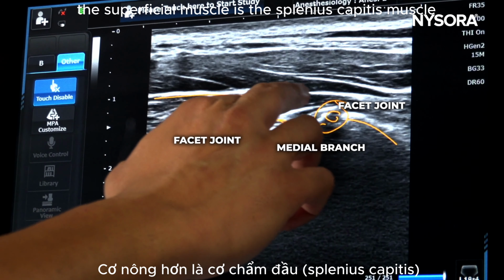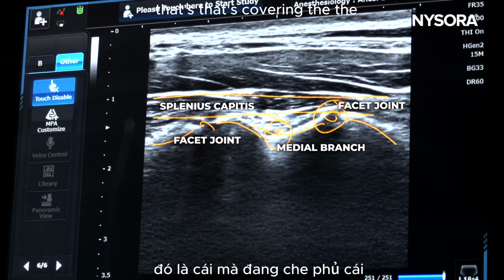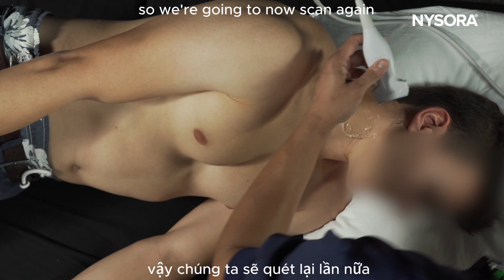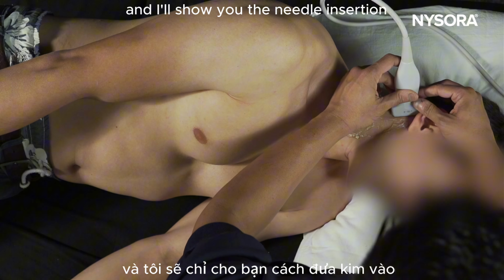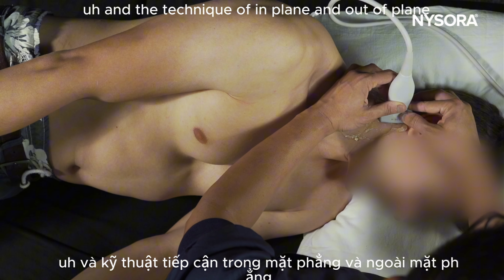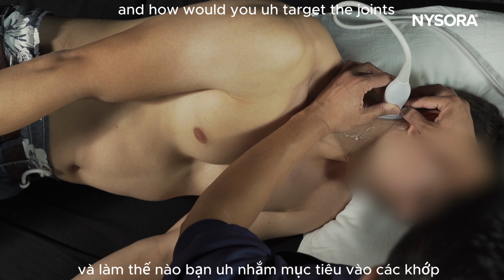The superficial muscle is the splenius capitis muscle that's covering the joint on the facet joint column. So we're going to now scan again, and I'll show you the needle insertion and the technique of in-plane and out-of-plane, and how you would target the joints.